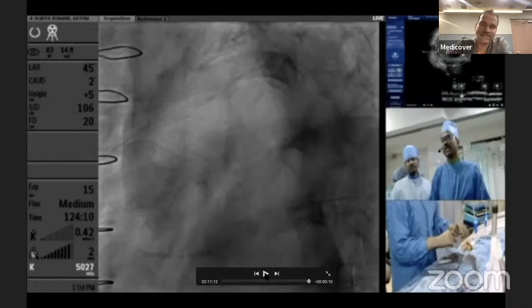If you have any such connections, those connections will sustain, and they become a track after some time. That is what I have also seen. If there is a large dissection, even if it is artificially created like a subintimal investment procedure, you give contrast, actually it clears, and then sometimes you would feel that maybe it is intimal because it is clearing, but it is not true. Sometimes subintimal micro connections are there and the contrast clears. So subintimal injections will not always be like no flow injections of a LAD or acute MI, where the contrast will just stay there. They also clear out.